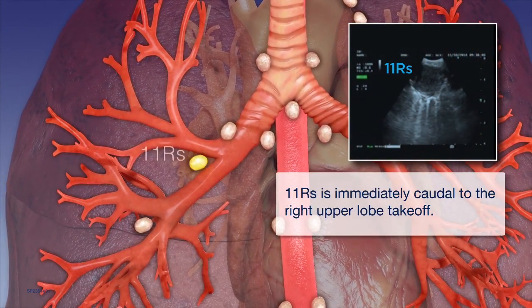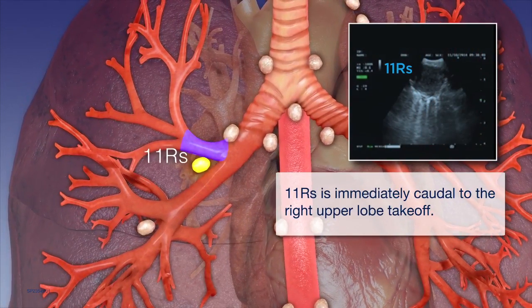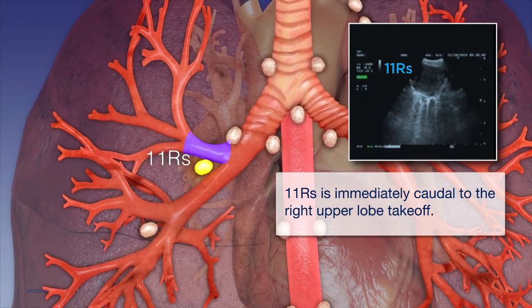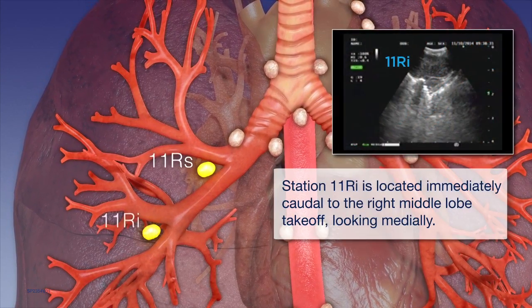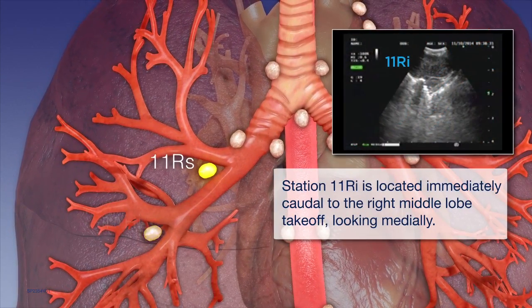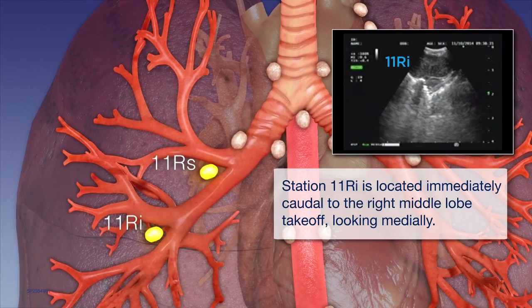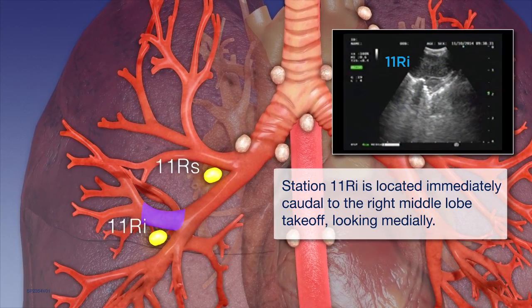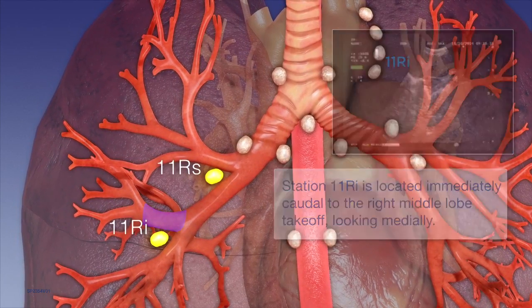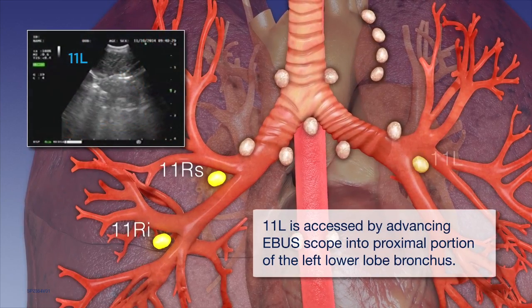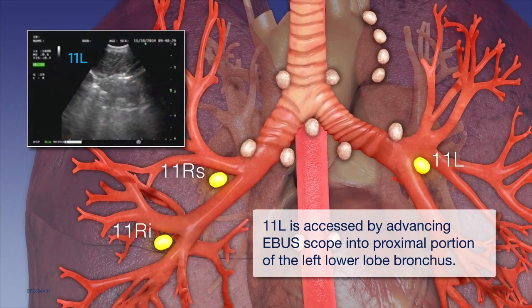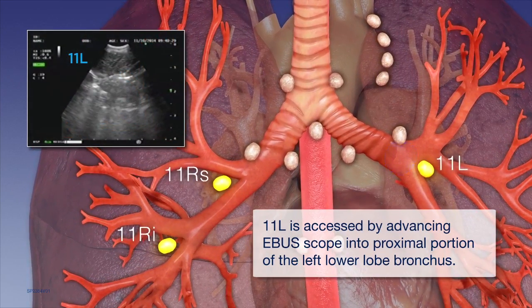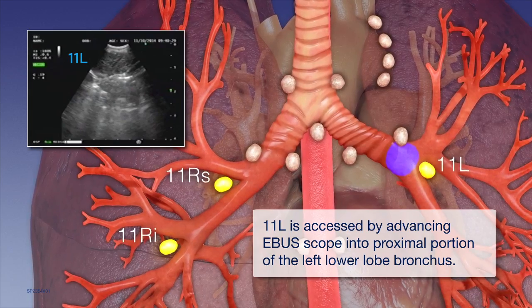Station 11RS is immediately caudal to the right upper lobe takeoff. Station 11RI is located immediately caudal to the right middle lobe takeoff, looking medially. Station 11L is accessed by advancing the EBUS scope into the proximal portion of the left lower lobe bronchus.